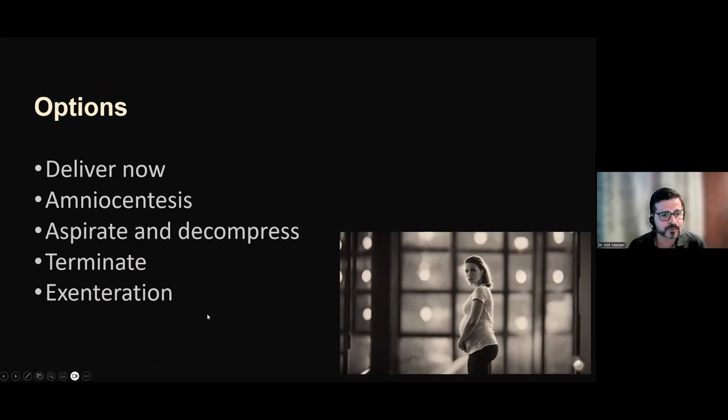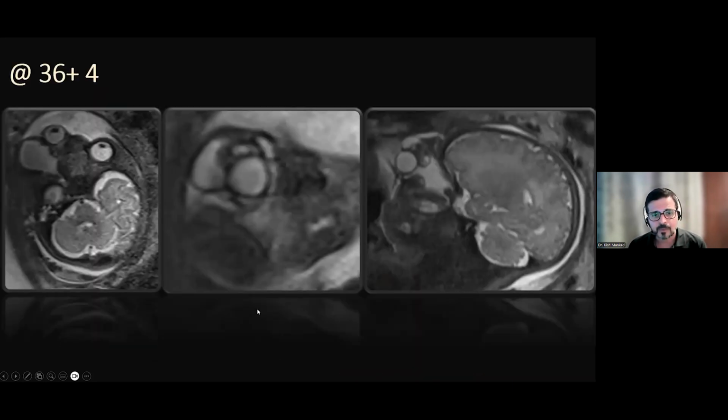And while you're still even wondering what might be the best option here, one of the things that could be done is watchful expectancy, and to do nothing and just wait and repeat, because time is the biggest teller. And in this particular case, this lesion basically starts devolving itself into more solid elements over time, quite a dramatic change. No intervention was done. But in the discussion and the development of the passage of time, we decided to repeat the scan. You can see that the cortex of the brain, etc., is developing quite well in the background. This child was delivered. They were close to term by this point in time.